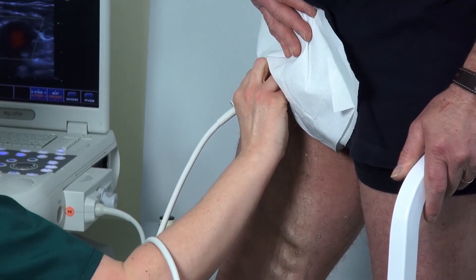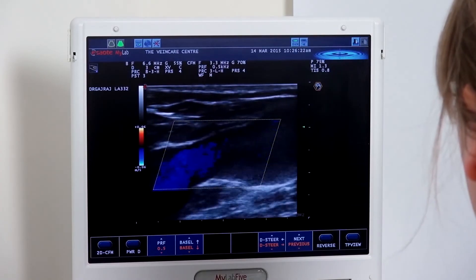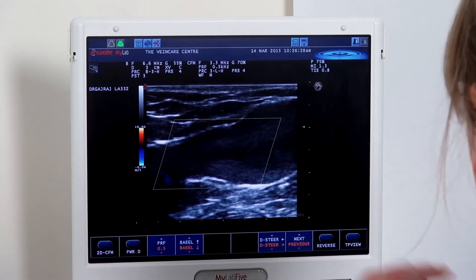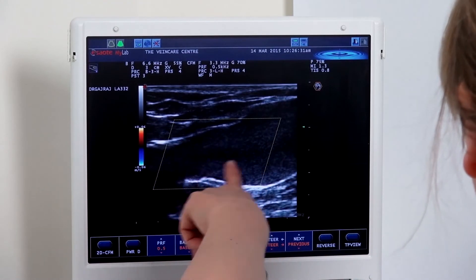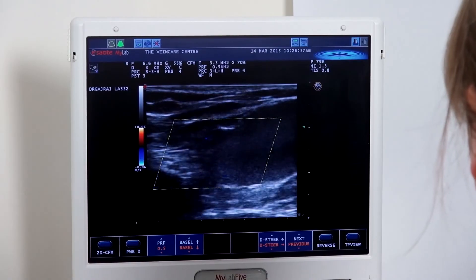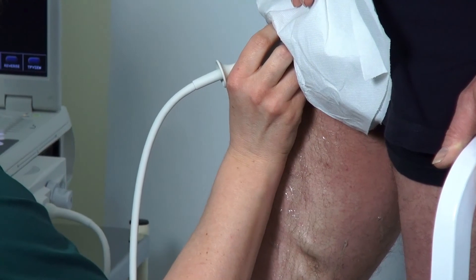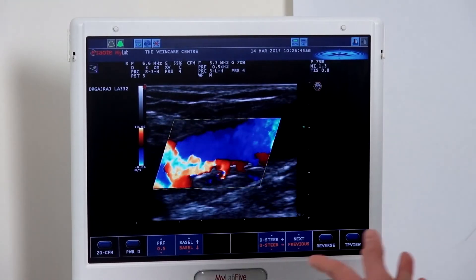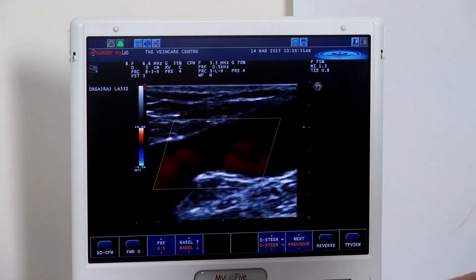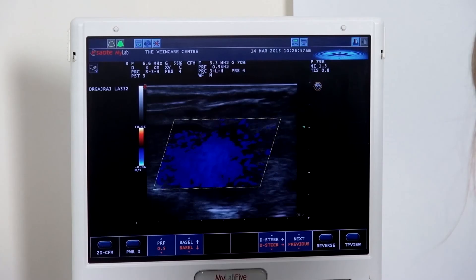To find the great saphenous vein, which we have previously demonstrated to be incompetent, we place our colour box over the top. We can see some low-level echoes inside — this is just stagnant blood flow. Following a good calf squeeze, we can see initial forward flow, and then we see red, demonstrating blood flow towards the probe — so it's coming back down from the heart — which again demonstrates incompetence of the valves within the great saphenous vein.